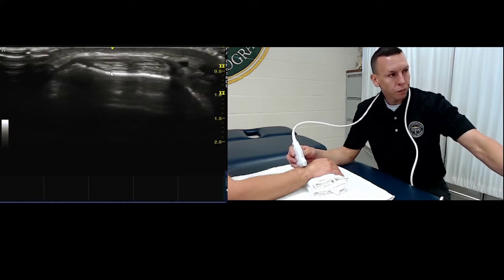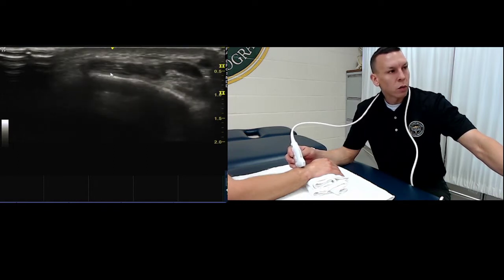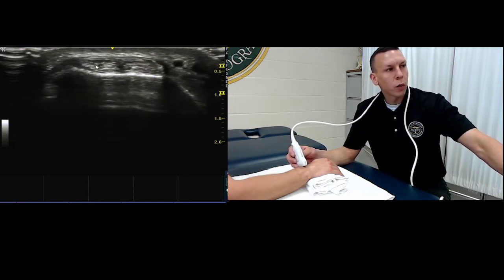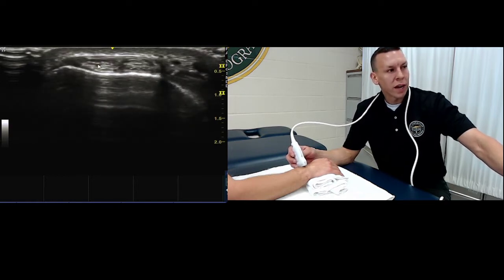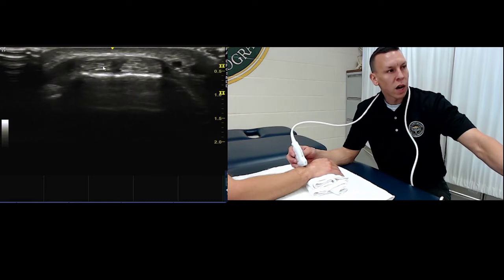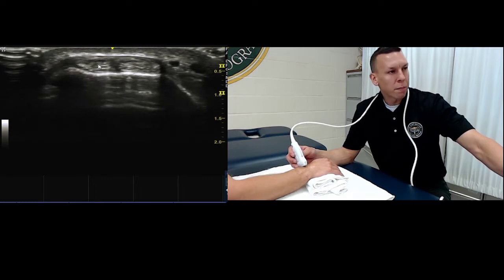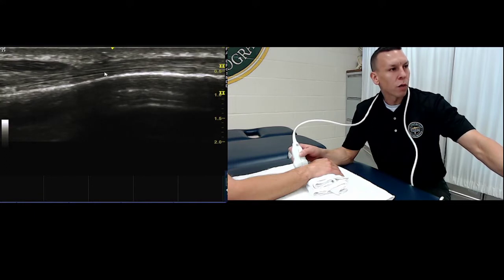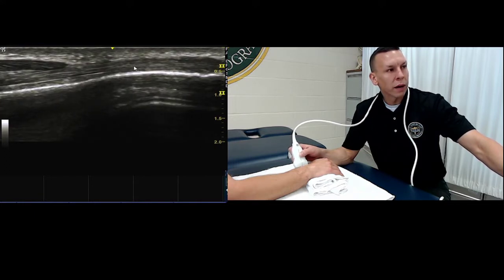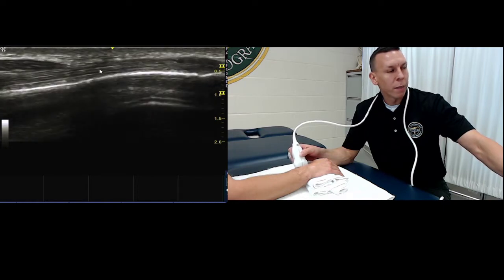proximal to distal. Each one of these tendons, I'd recommend that you scan them, and we're looking for any kind of fluid surrounding them, like a tenosynovitis, or even tendinopathy, where you can see this really nice hyperechoic appearance, and does it lose that appearance, become enlarged and a little more hypoechoic. But then we can also look at them in long axis, and we're looking for that nice fibrillar pattern of the tendons. And again, here we'd be looking for any kind of fluid around them.